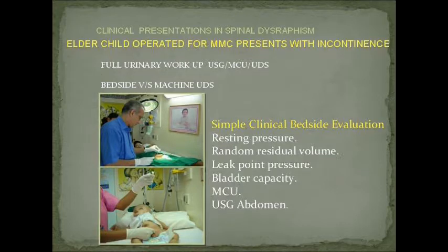In many of these patients who come to me with spina bifida, in the slightly older group, we perform a simple clinical bedside evaluation, which consists of these investigations plus a bedside measurement of pressures.